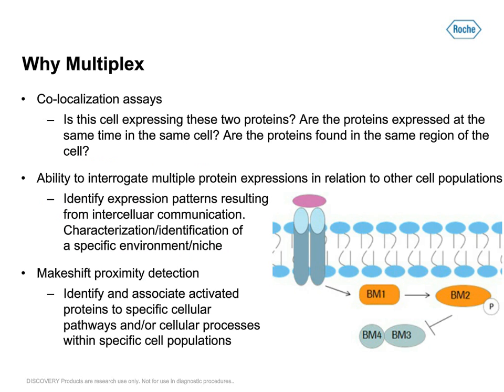A lot of researchers multiplex for the reasons of just seeing if there are proteins of interest that are co-localized within the same cell. Is this cell expressing these two proteins? Are they expressed in the same cellular locale?